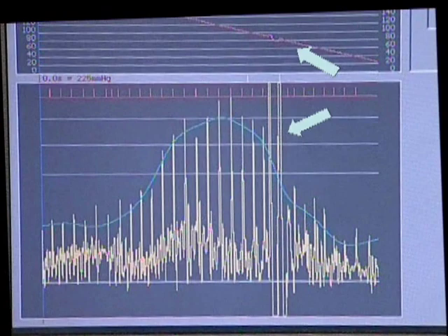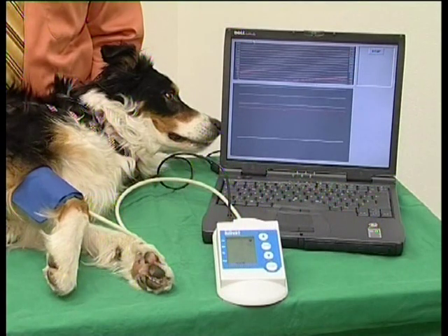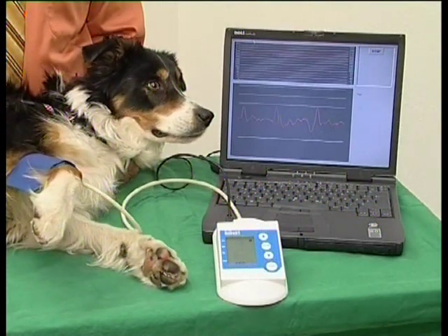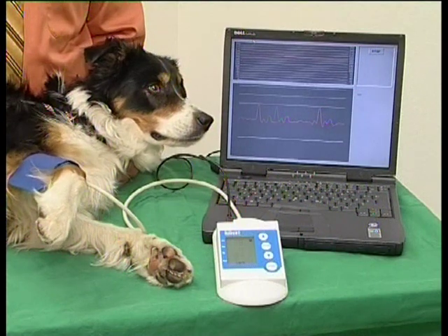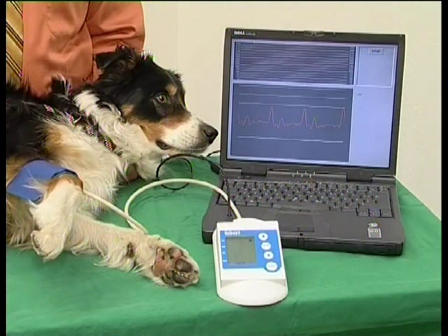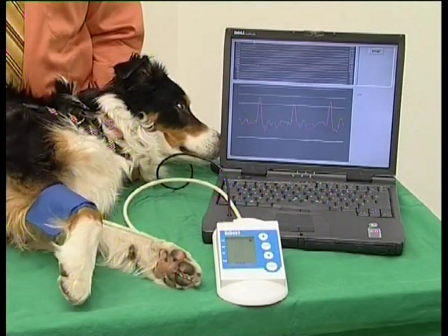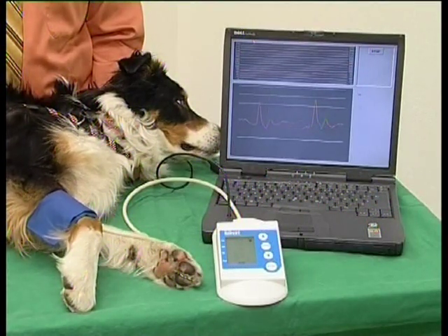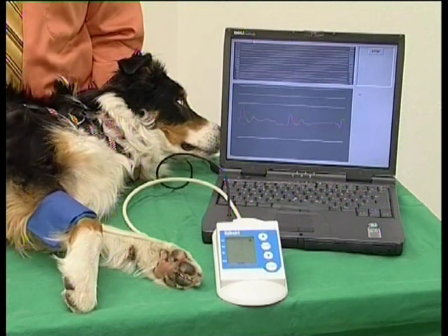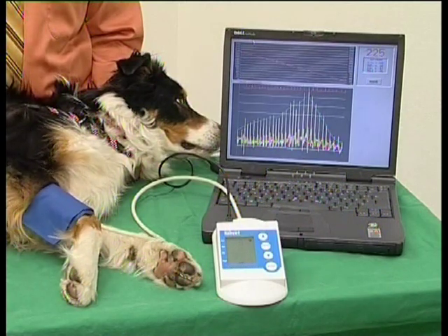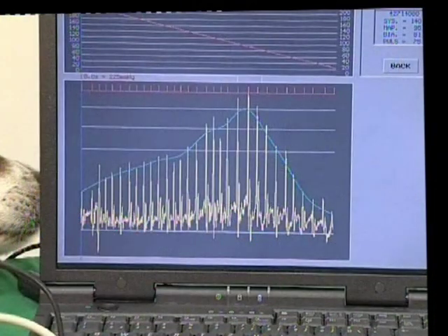Remember, the dog seems relaxed but still artifacts appeared. Therefore, always make sure the animal is put in a relaxed position, which avoids as many artifacts as possible to allow successful measurements. Watch the reading on the laptop screen — even some movements of the leg do not interfere with the measurement, as no weight shifting nor active muscle contractions take place. This is a perfect reading: linear deflation without interruption, no artifacts, regular measurement pattern. The entire reading was done within 20 seconds.